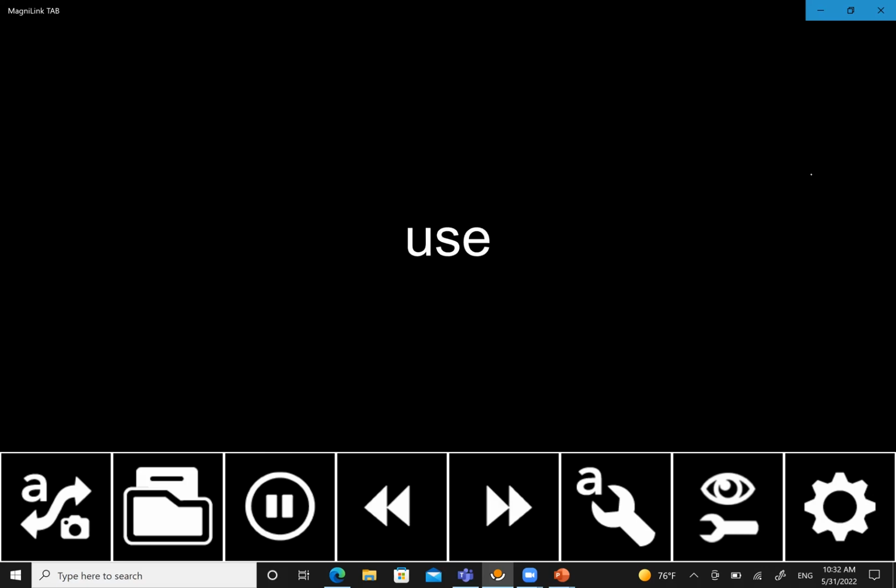This makes the unit ideal for use in the class. You can change the voice. You can slow it down. You can speed it up. Again, you want to just really work with the person and find out what's best for them.